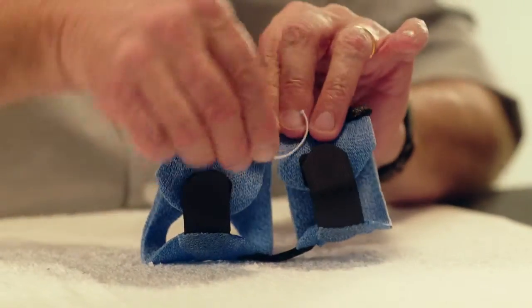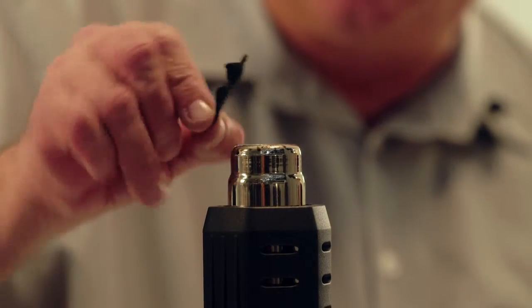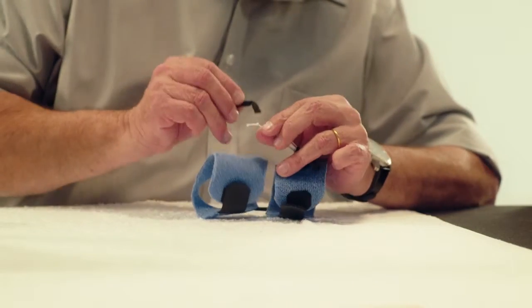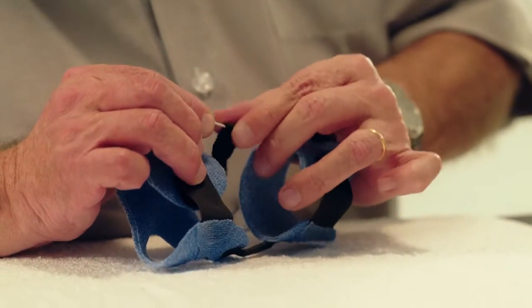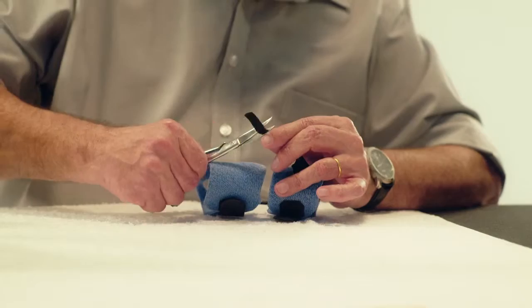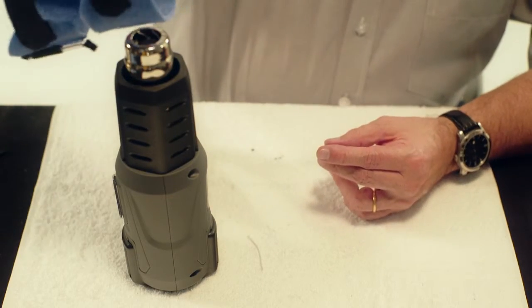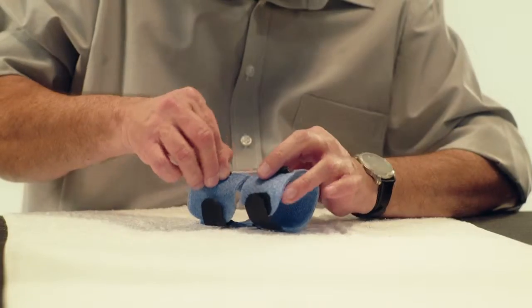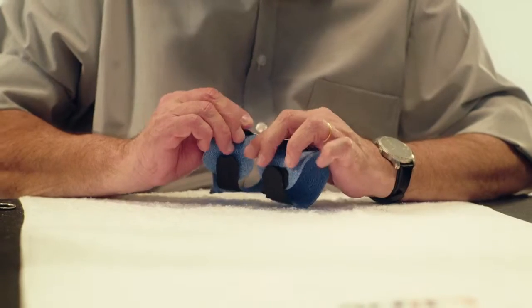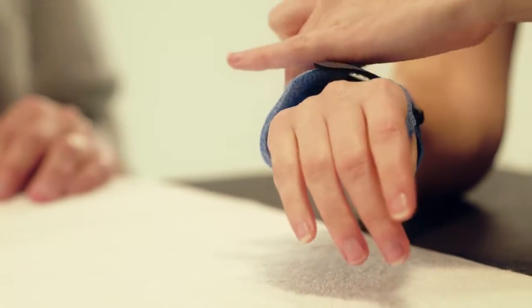Apply tension to the elastic thread and make a knot. Heat a piece of Orficast with the heat gun and roll this over the knot to secure the knot. Heat the Orficast protected knot with a heat gun. Stick the knot with sufficient tension onto the distal ulnar part of the orthosis. The orthosis is now ready for fitting on the patient.